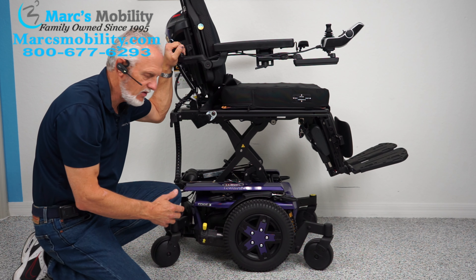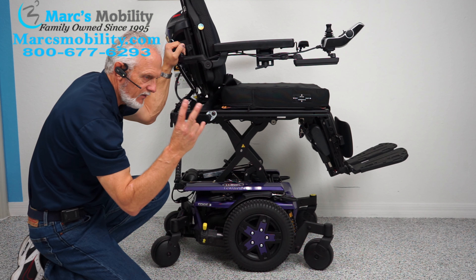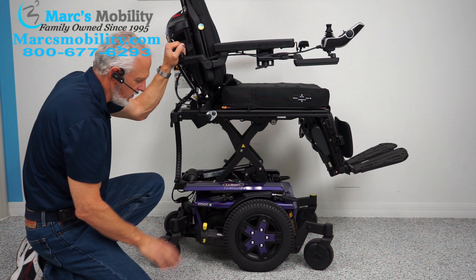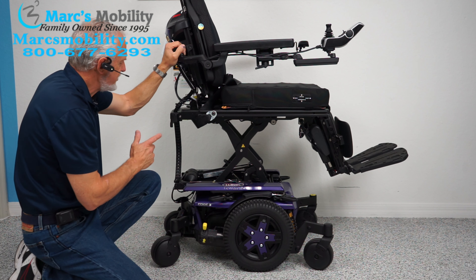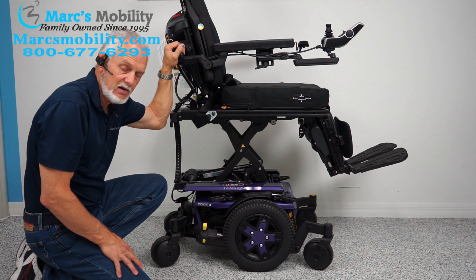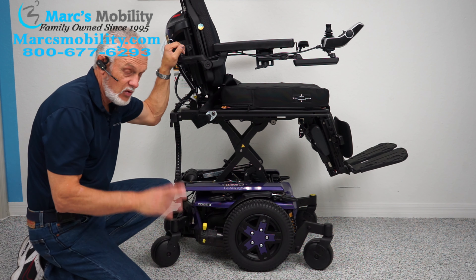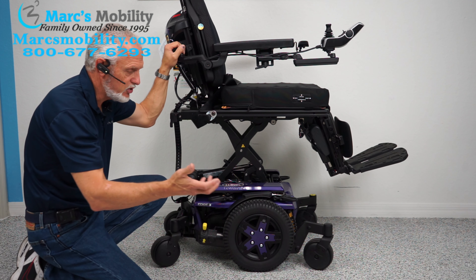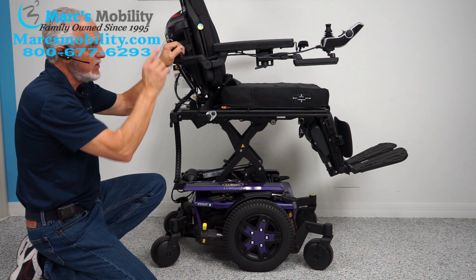You have anchor points here — solid anchor points tied to the frame. There's one here and one here; this is where you secure your chair for transporting on your van or on your lift. You have two on this side and two more on the opposite side, so four anchor points total. Each wheel has an independent motor. This chair right now weighs probably 440 pounds — a lot of metal, a lot of engineering. Great chair.